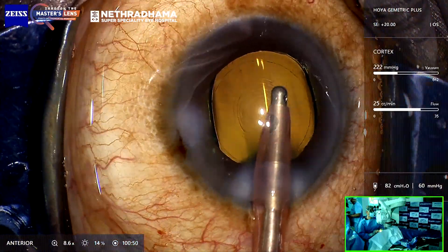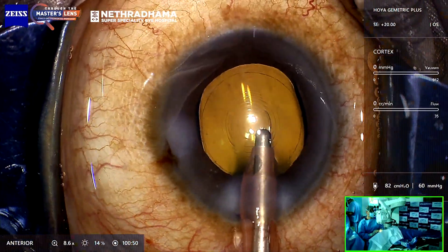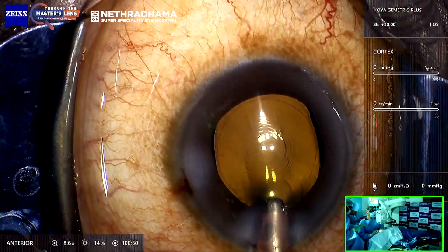The other nice aspect is that the haptics do not stick to the optic. I just turn off irrigation and then come out.